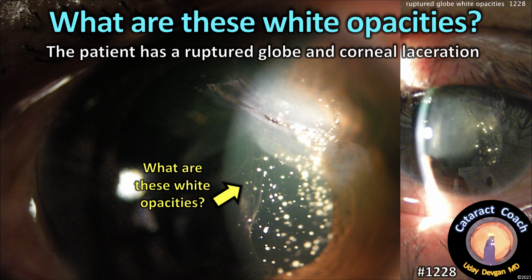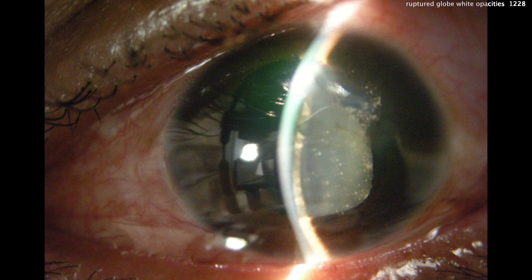What are these white opacities? The patient has a ruptured globe and a corneal laceration. The resident saw the patient and said yes, there's a flat anterior chamber, there's a corneal laceration, and it's a ruptured globe from a gardening injury. When we zoom in here, what are all these white spots? The resident didn't know — he was totally flummoxed. Look at those white spots — they're coming through that laceration onto the ocular surface.